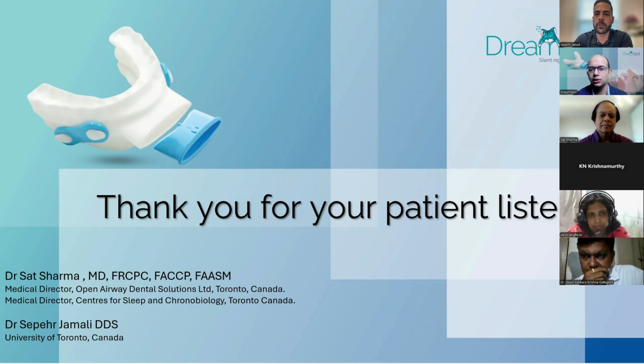Sure. Another question from Dr. Amrita: is there a possibility that you will turn the nasal breather into a mouth breather? I haven't seen any records of that, and I'm not sure that's going to be possible, because we are not promoting breathing through the mouth. When you are sleeping, breathing is completely unconscious, and we have very little control over that. So I'm not sure how it can stop people from breathing through the nose, but it just gives them another passage. If the nose is clogged, there is another path for air to come in.